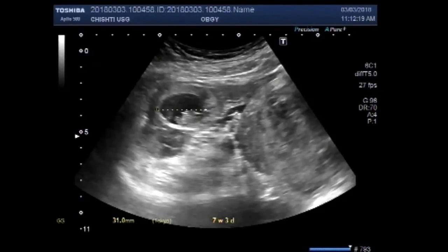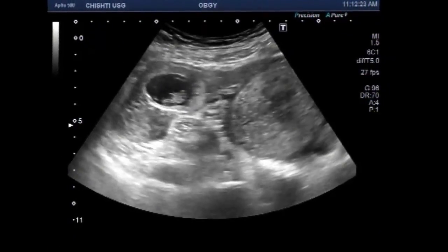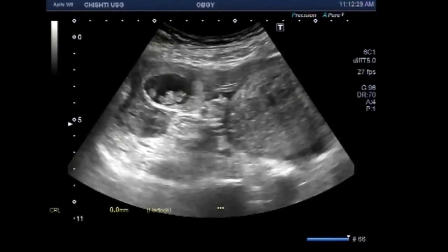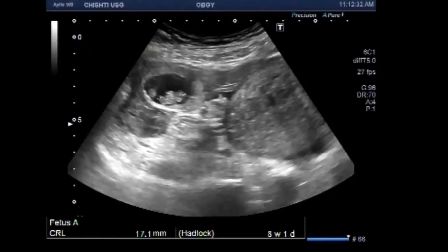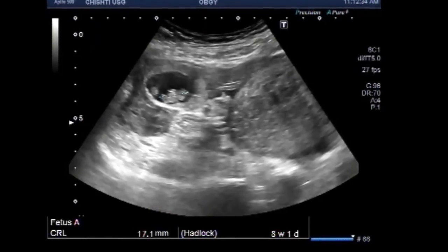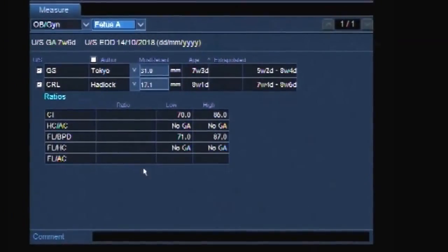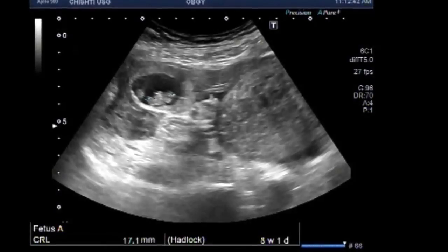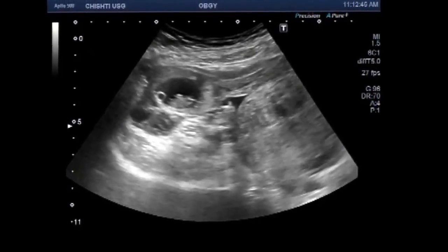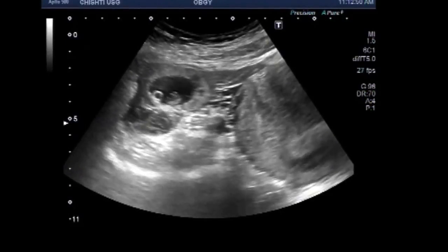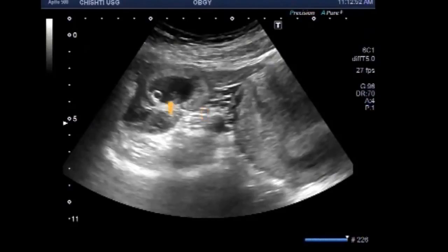Now you can see the measurement of the gestational sac and crown-rump length of the fetus. This shows a pregnancy of about 8 weeks, 7 weeks 6 days. A small umbilical vesicle is also visible — this is the umbilical vesicle.